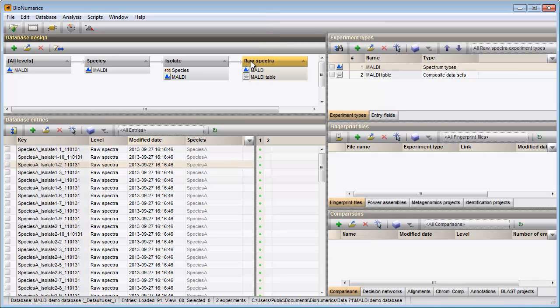The spectrum type MALDI is present in the Experiment types panel. Since a PCA is performed in the comparison window, I first need to make a selection in the main window. I will work on the data in the lowest level, the raw data level.